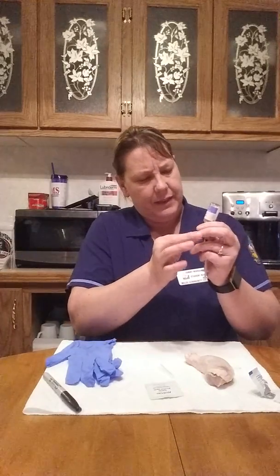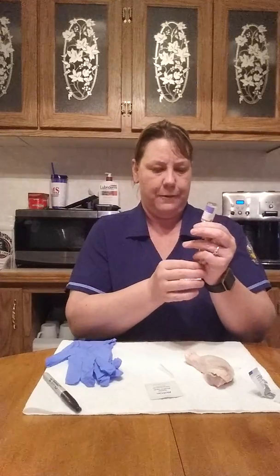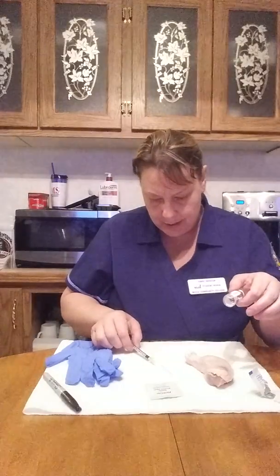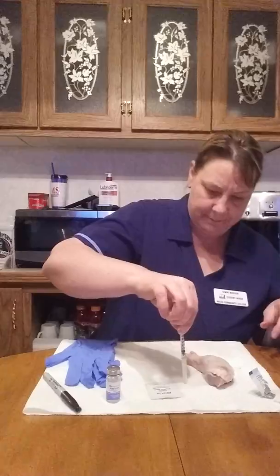And so once I have that, I can kind of flick the side and get the bubbles out. And so once I have the medication ready, I'm going to go ahead and place the top back on. And now we're going to go into the room and meet the patient.